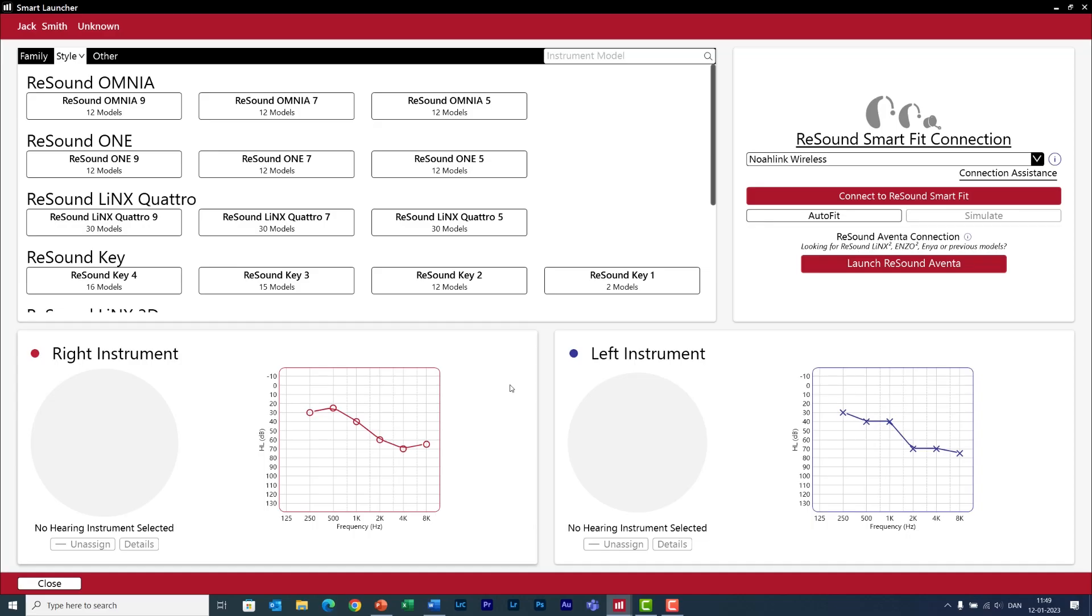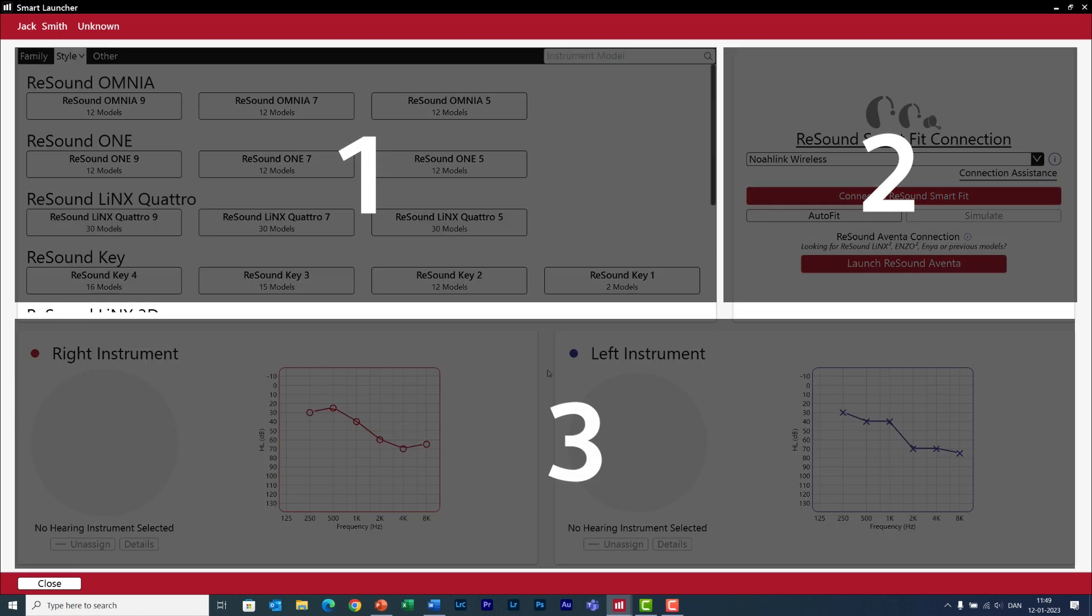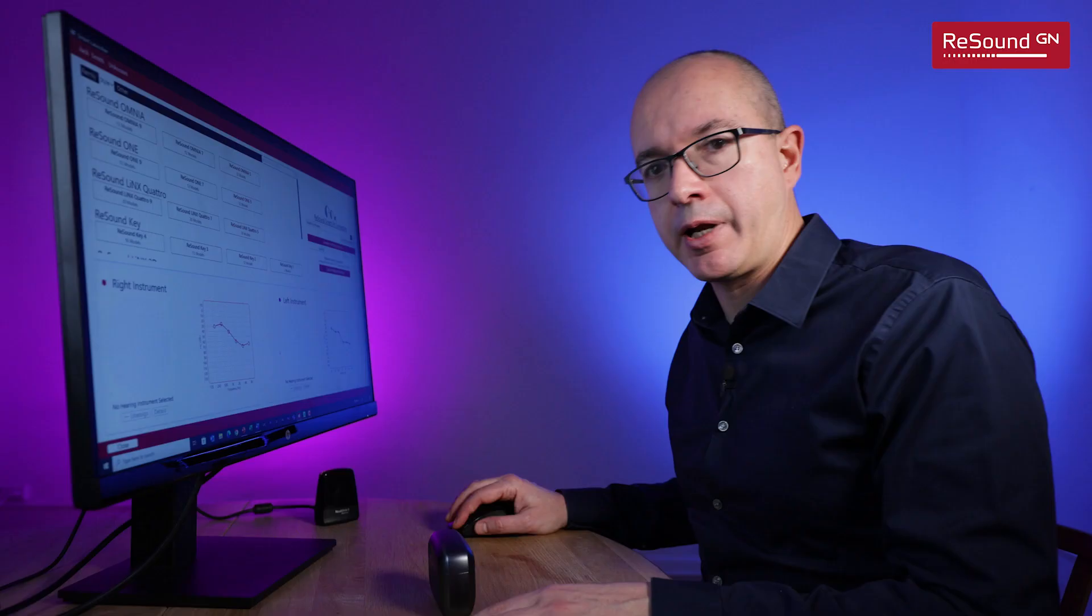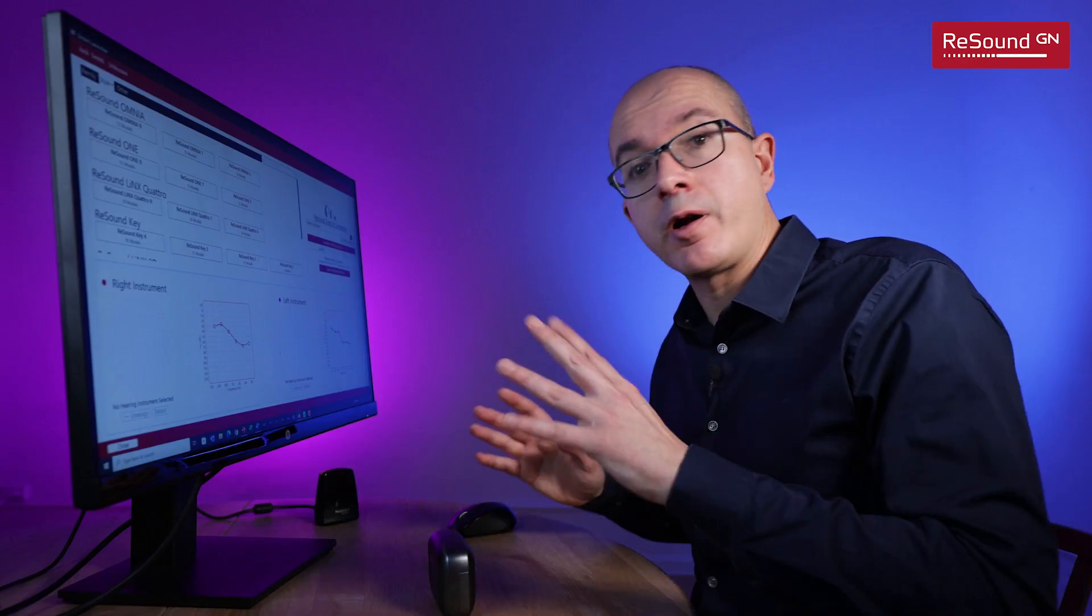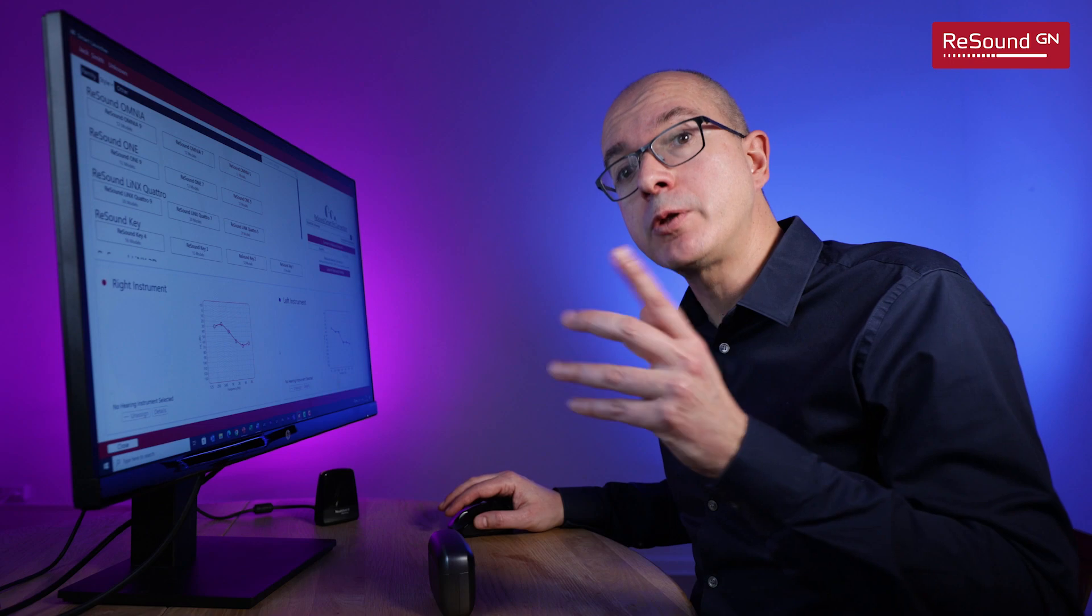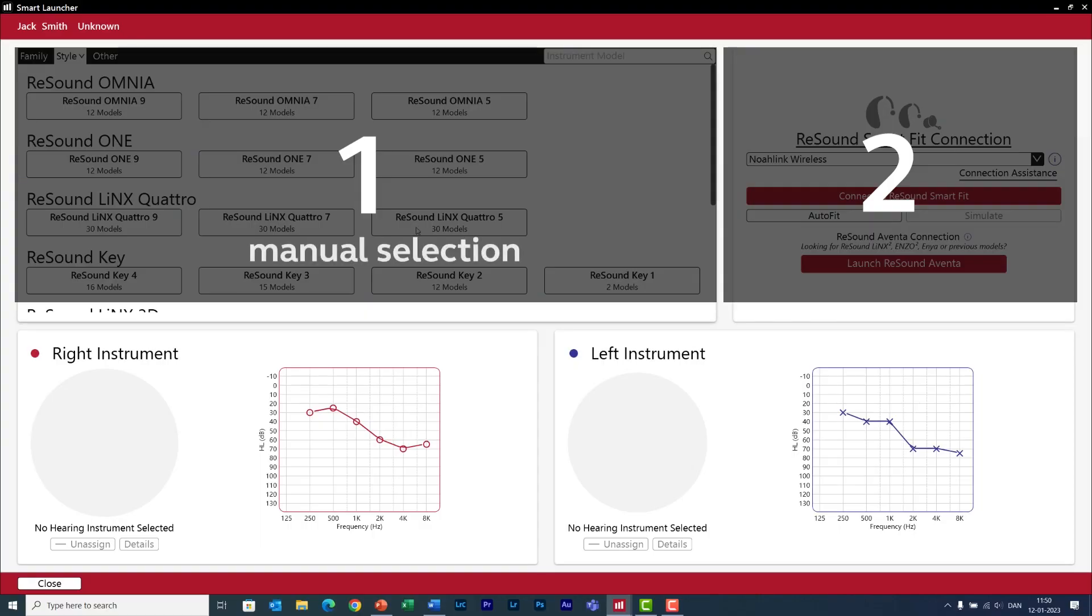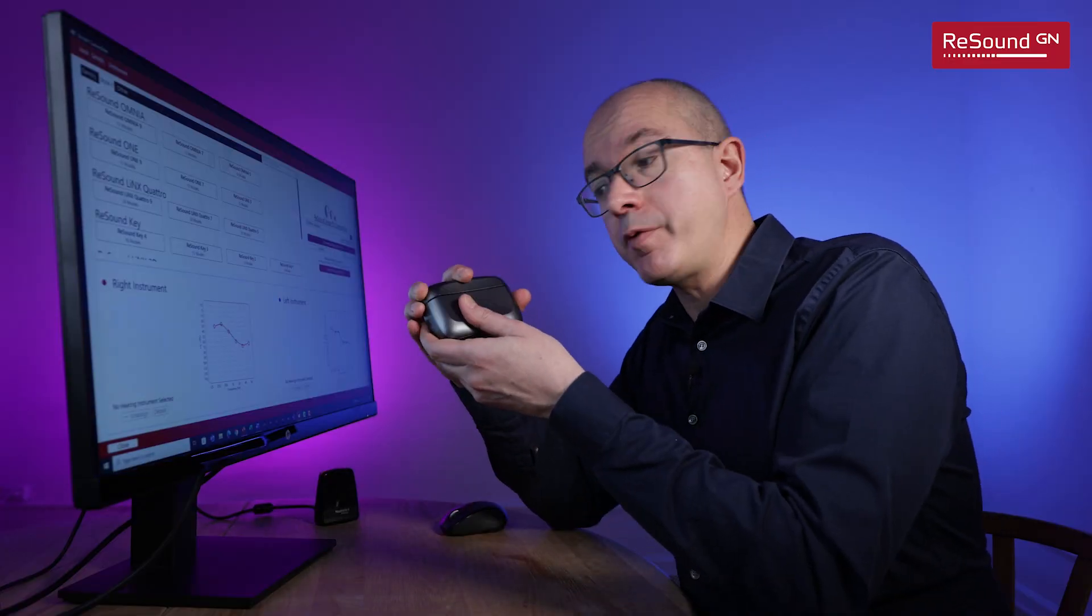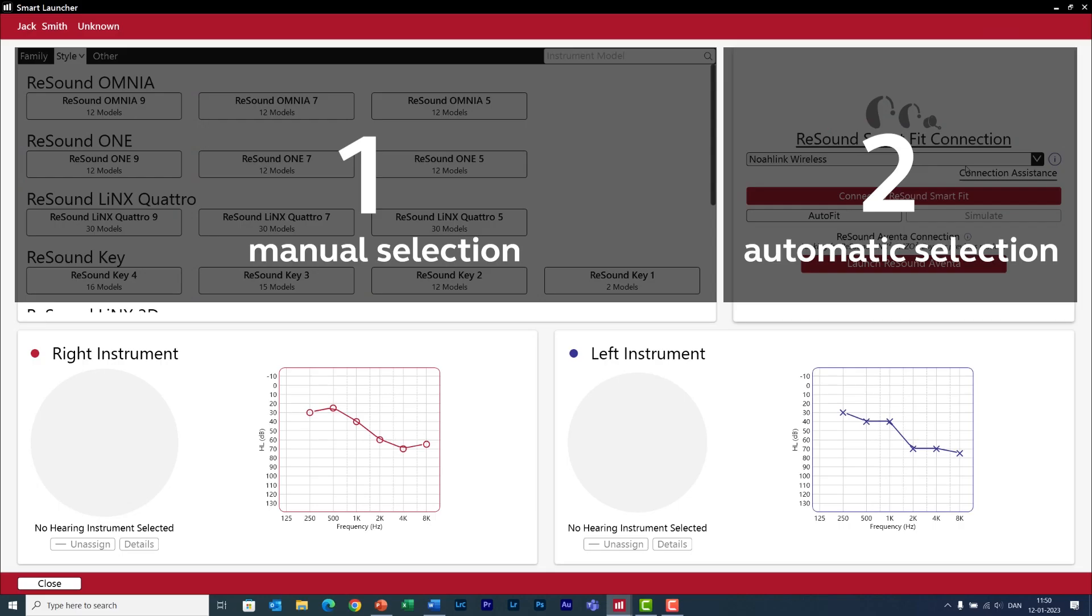This is the first screen that you will see when you open the fitting software and it consists of three sections. In section 3 you see the audiogram of your client and which hearing aids are currently assigned to this person. Now as this is a first fit there are no instruments assigned, and we need to do that either manually in section 1 or automatically if you already know which hearing aids you want to fit in section 2.